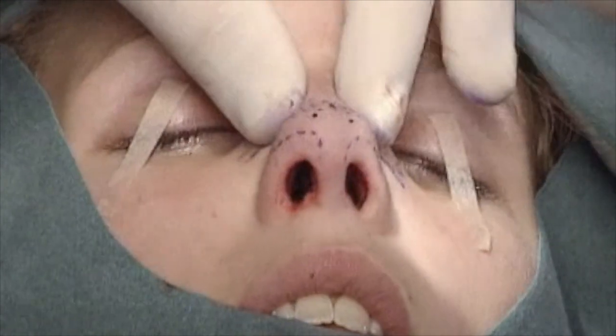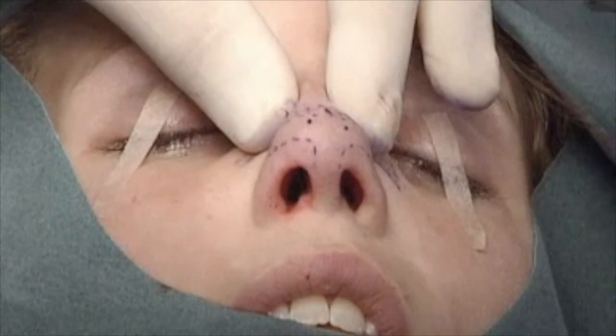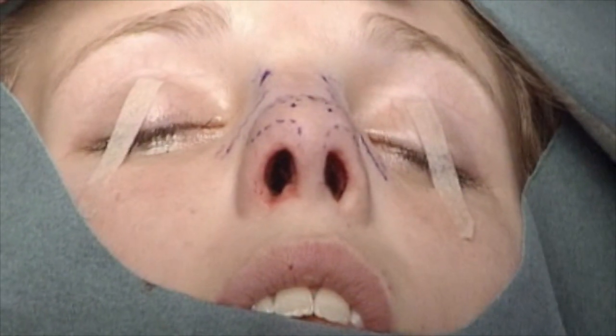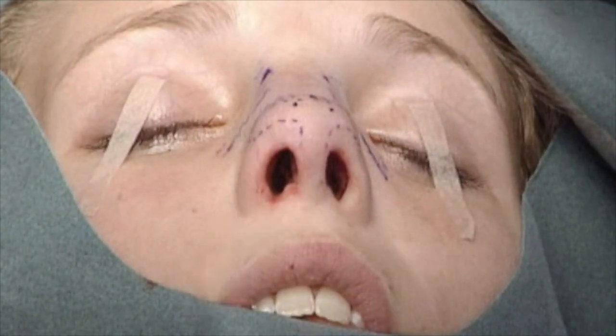So now we have to do micro osteotomies. We start with the medial oblique. We first sharpen the osteotome.